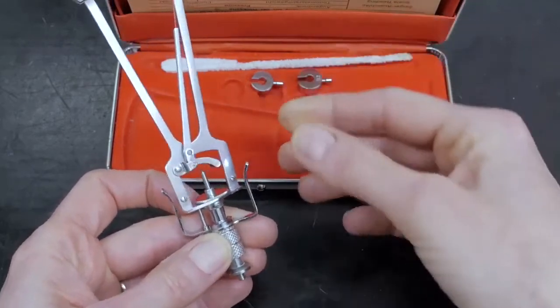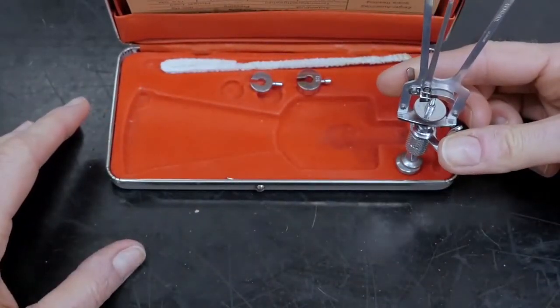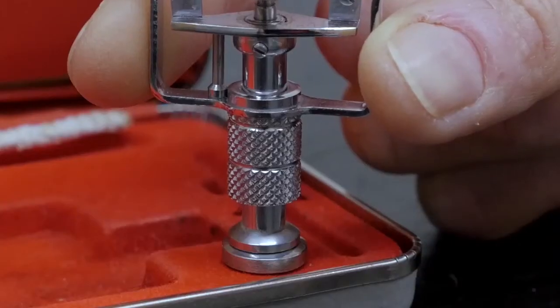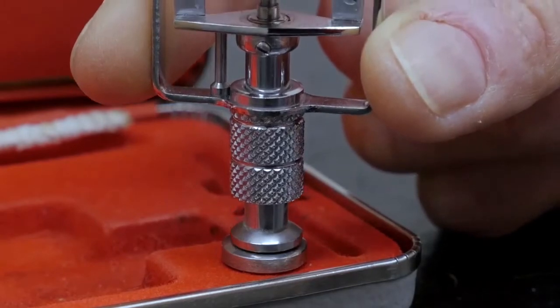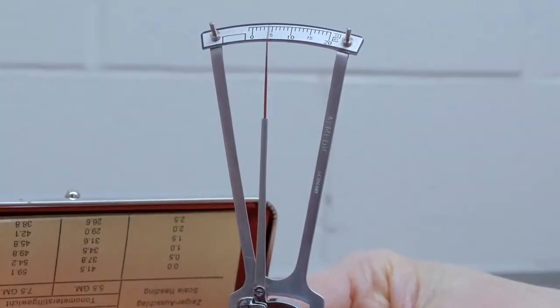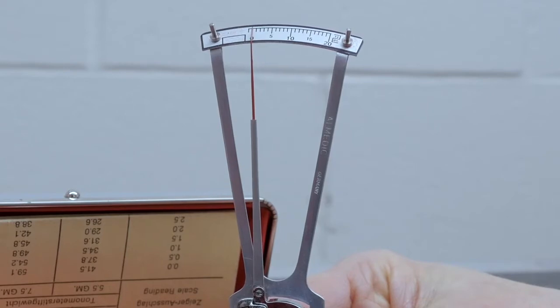Before the Schiotz tonometer is used on the patient, it should be calibrated on the convex metal test cornea provided with the tonometer. With the 5.5 gram weight in place, the Schiotz tonometer is held by the side holding brackets, and the foot plate of the tonometer is rested perpendicularly on the metal cornea. A reading of 0 should be obtained, which ensures that the reading needle has not been bent and that the instrument is functioning properly to perform tonometry in the patient.